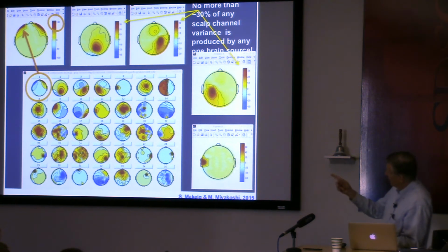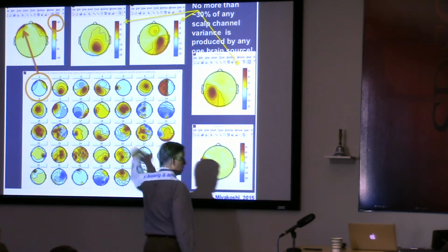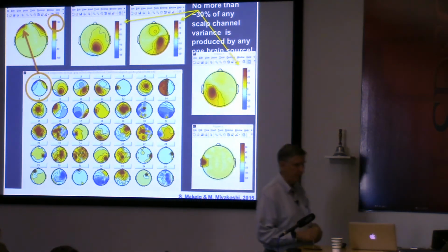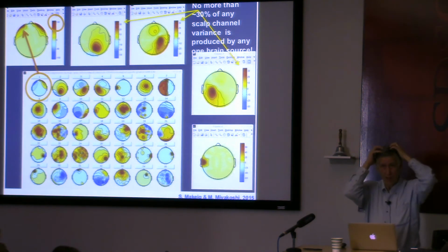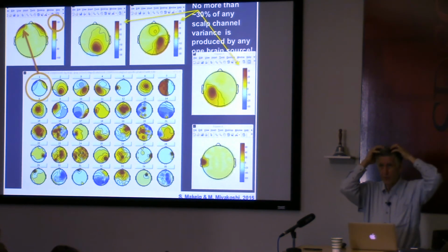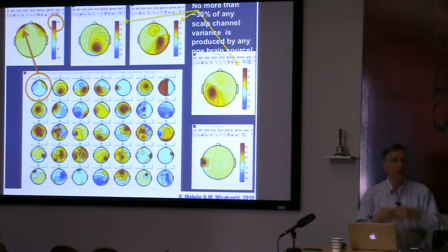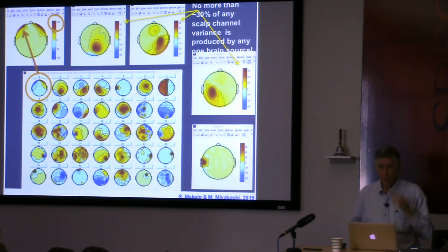Now this is not a very good decomposition. When I see things like this in the top components, I think there's a lot of noise left in the data. You need to pre-process the data better and take out things that will never occur again, which are therefore independent of everything else. So if the subject, for instance, were to go like this, in that 1 second they would put in hundreds of maps that would never occur in the data again. It would be independent of everything, and ICA would have to say, whoa, what should I give a component to?